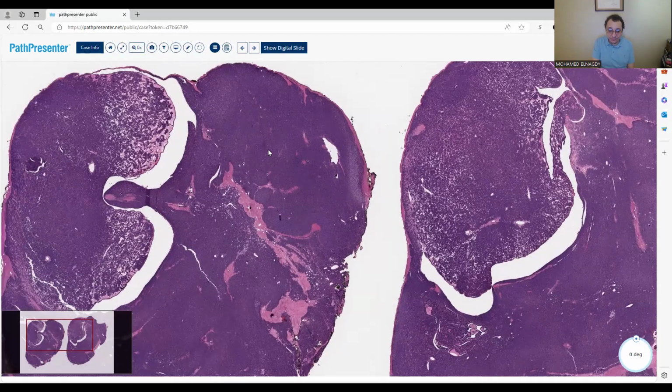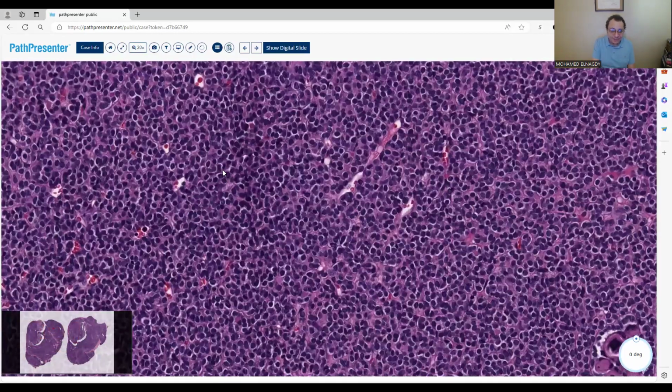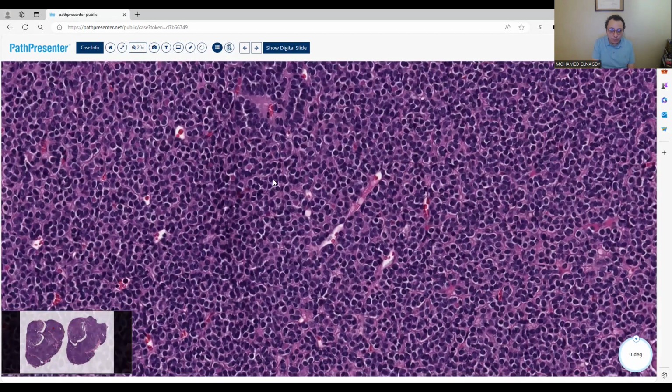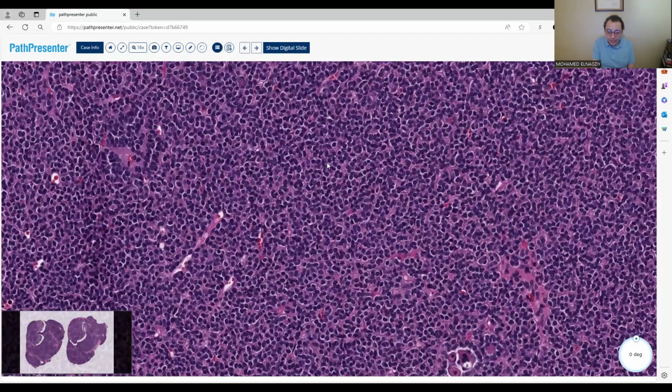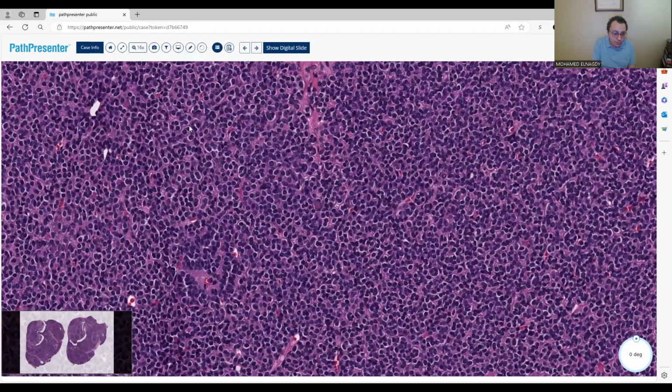It looks like metanephric adenoma. Yeah, so see, let's go high power. Can you see that? It's all blue cells trying to form tubules like this one. And I will catch some more tubules like this one, this one, this one. See, dense blue cells with very little stroma. Yeah, that's the WT1, CD57, BRAF. Whatever. Yes, good job. So it's BRAF.